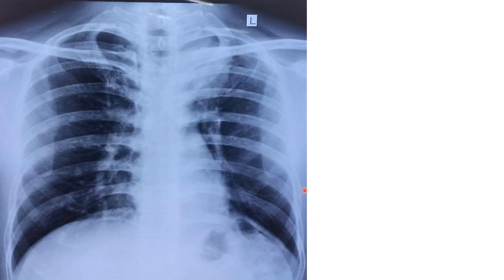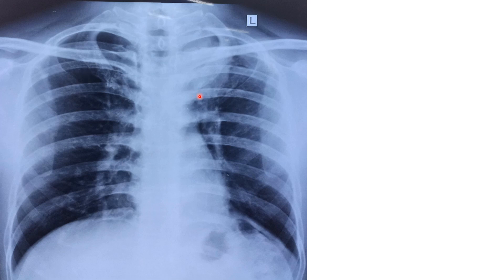In this X-ray, compare the right and left lung carefully. You can see a difference — on one side it is well aerated, but on the other it is not. There is a lesion up here; this is its margin. This area is difficult to find because of the confluence of bony structures, but it is not normal. Focus on the intercostal spaces and compare side to side — there is definitely a mass lesion in the apical area of the left lung.